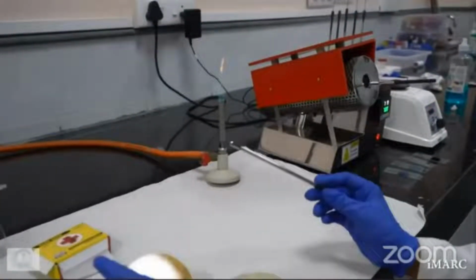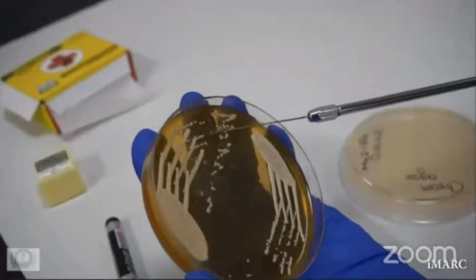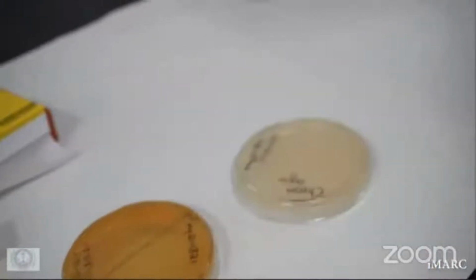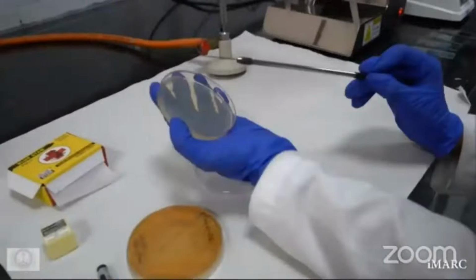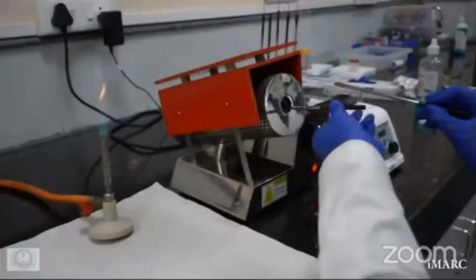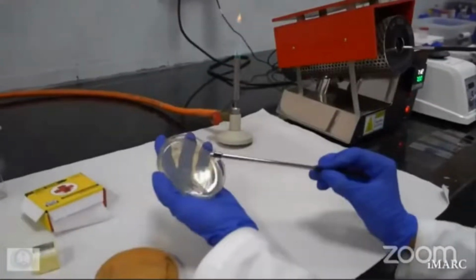After getting a preliminary idea about the yeast from the cornmeal agar, the next test that can be performed is the CHROMagar. The CHROMagar is a chromogenic agar which helps us to determine the species of the Candida with the help of the color that is formed on the media.